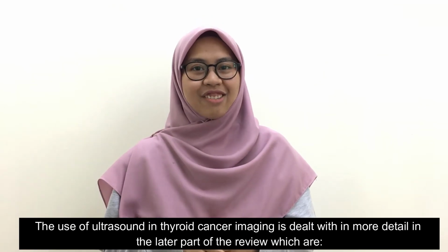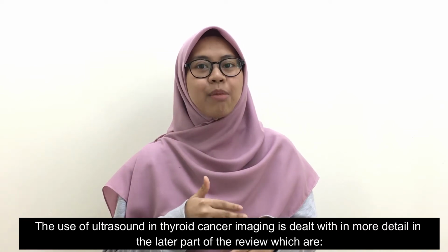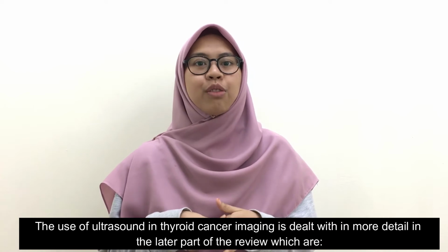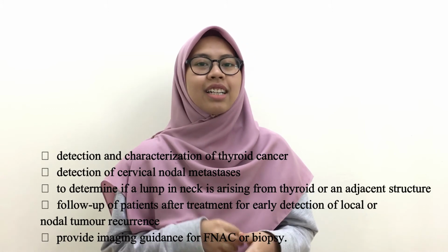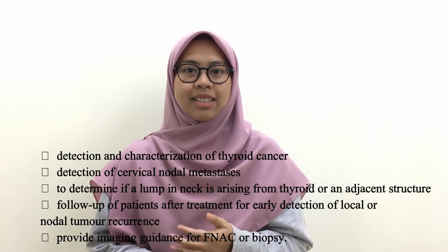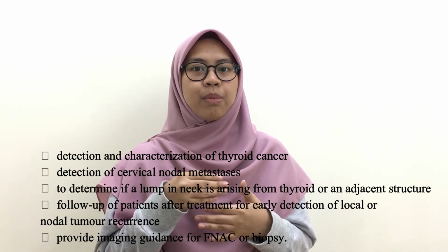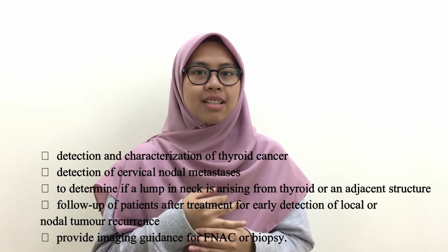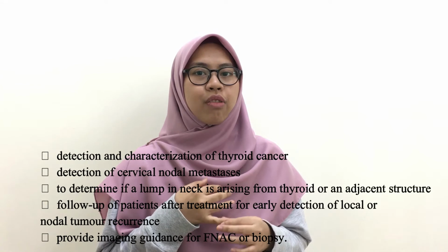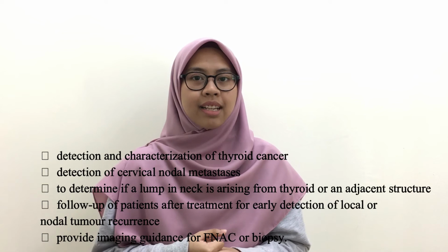The use of ultrasound in thyroid cancer imaging is dealt with in more detail in the later part of the review, which are detection and characterization of thyroid cancer, detection of cervical nodal metastases to determine if a lump in the neck is arising from the thyroid or an adjacent structure, follow-up of patients after treatment for early detection of local or nodal tumor recurrences, and provide imaging guidance for FNAC or biopsy.